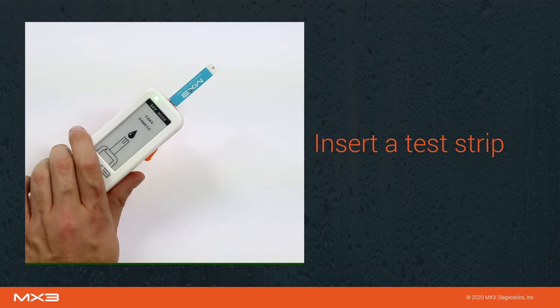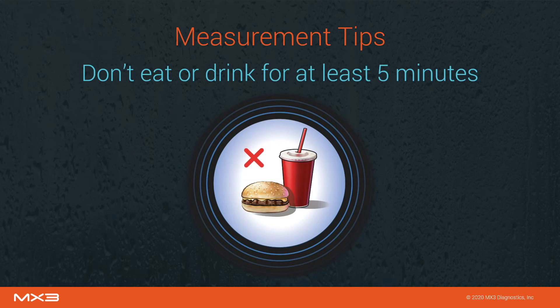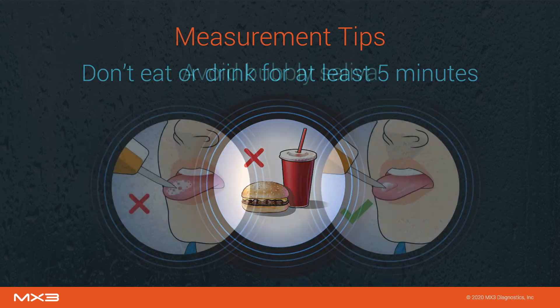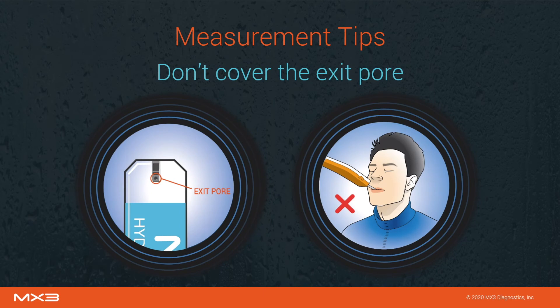The MX3 lab will now prompt you to take a sample. Instruct the user to swallow all the saliva in their mouth, generate a fresh saliva sample, and slightly stick out their tongue. A few things are important to note before taking a measurement. A user should not eat or drink for at least five minutes before being measured, as this may interfere with the measurement result. When collecting the saliva sample, try to avoid bubbly areas of saliva. If there are no clear areas, ask the user to swallow all saliva and generate a fresh sample. Also avoid covering the exit pore of the test strip, which may occur when a user closes their mouth on the strip. The easiest way to avoid this is by tapping against the tongue on a downward angle.